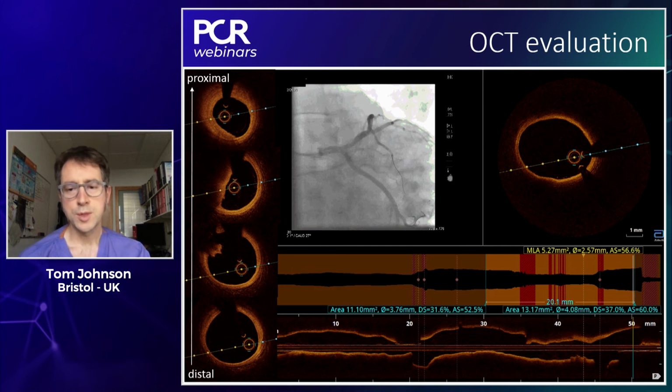And then most importantly, I think we see at the ostium of the LAD that there is evidence of significant disease. And there's often a debate, and the question that was just asked, Goran, about a Medina 001 ostial circumflex, how would we treat?